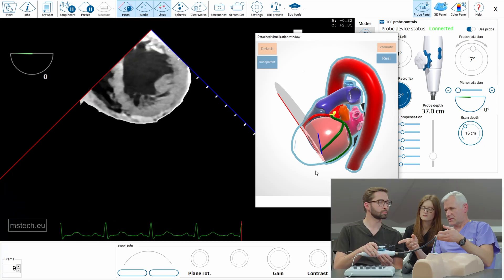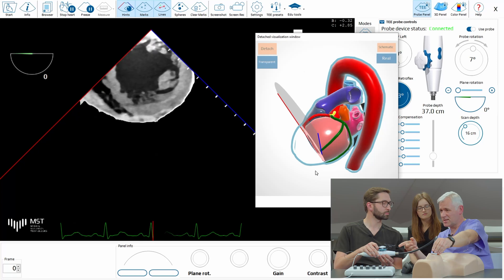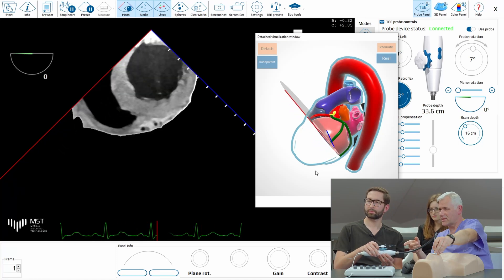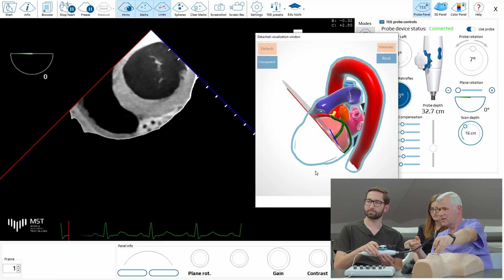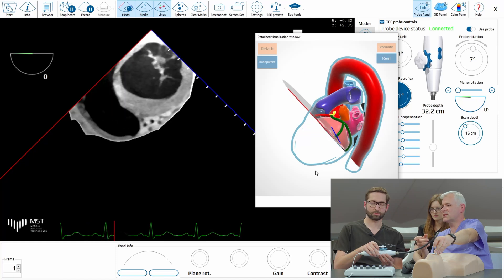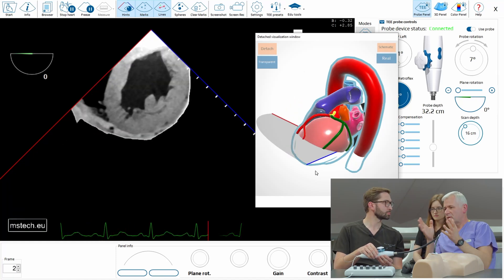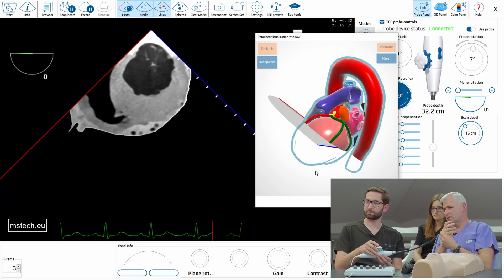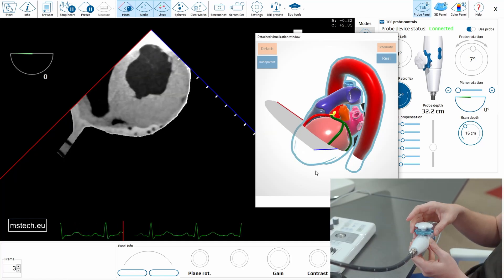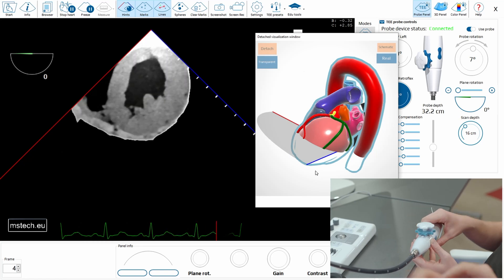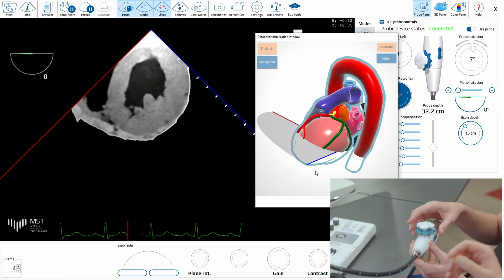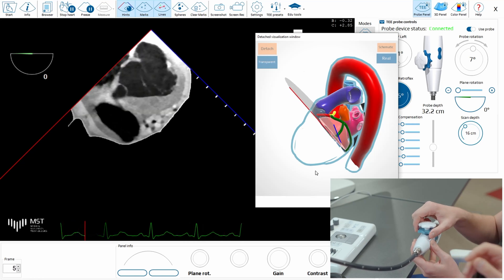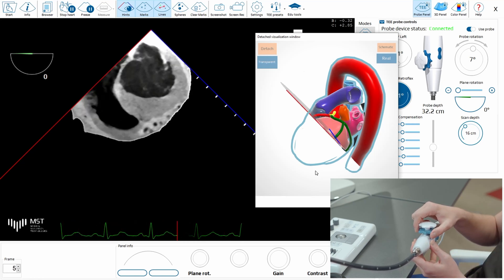If you are slightly deeper, you can slowly pull back and return to the mitral. This is the way you can precisely locate your plane along the left ventricular axis but perpendicular to it. With anti-flex, this is the transgastric basal view where the mitral valve is.